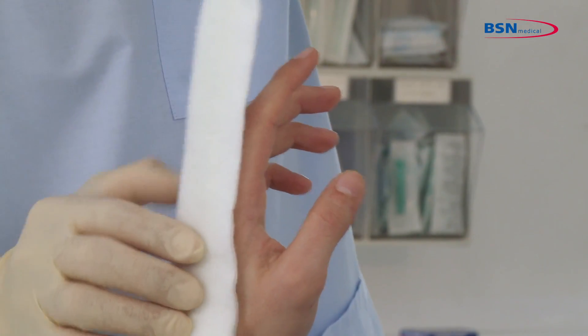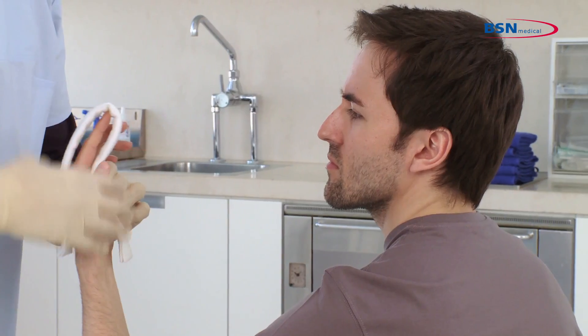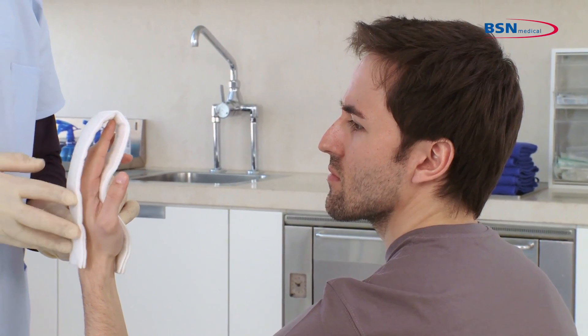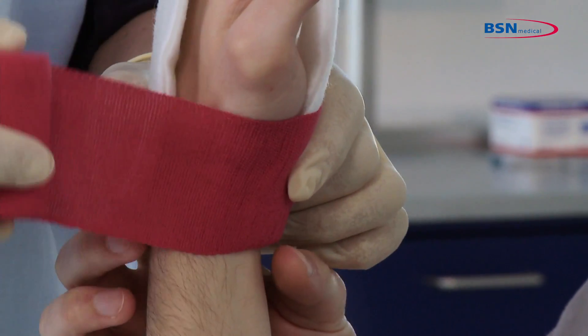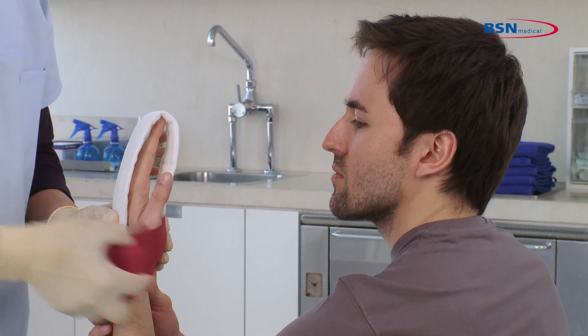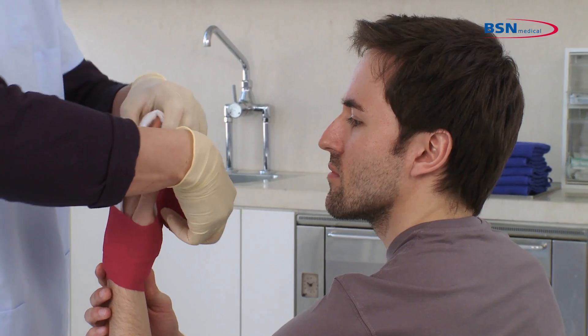Slide the splint on the finger and make sure both ends conclude at the wrist joint. After this, anchor the bandage at the wrist joint. To get the right immobilization, go up the hand and through the web space of the thumb and index finger.